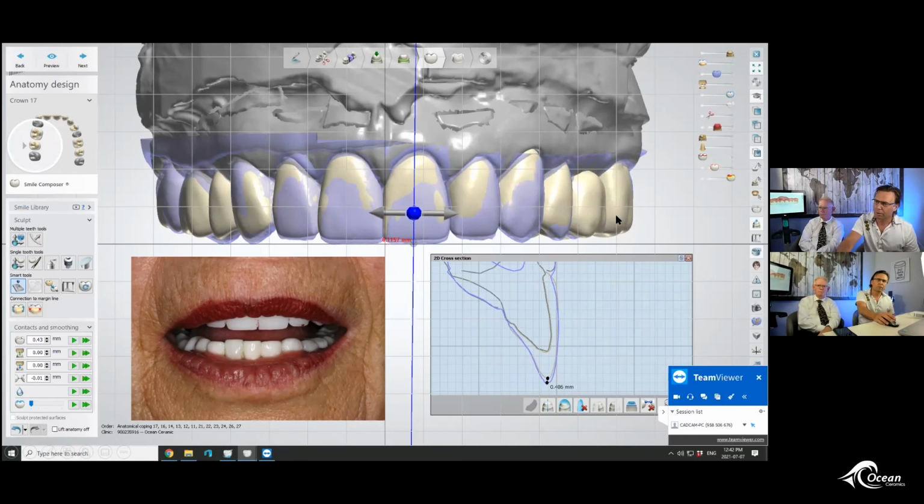Yep. The scanning pattern, if they want to capture the palate accurately. I know it's a question that's probably back a little bit, but yeah, scan pattern. Basically, linearly over the palate. Let me try this. This is kind of handy here. After you do your scan pattern, it's coming out from the back of the neck, yeah. Once you have your teeth pattern here, go back and forth like this. And back. It's handy having the stage prop here, Mark. Okay, good question.